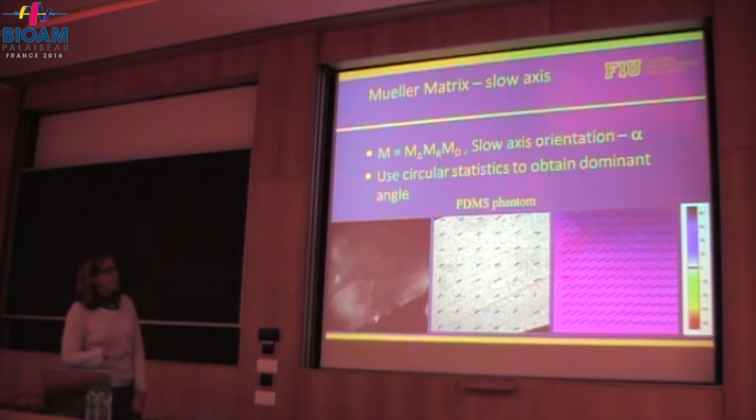So if we compare this with the OCT imagery, this is the normal en face image, and this is the OCT image with the averaging. You can definitely see this striation, and the Radon transform on something like this is very efficient, it will pick it right up. Again, we work on sub-areas, so we really calculate this angle in tiny spaced voxels.